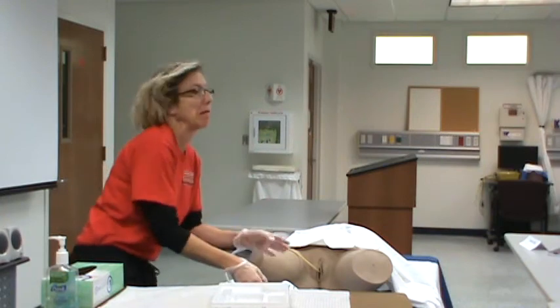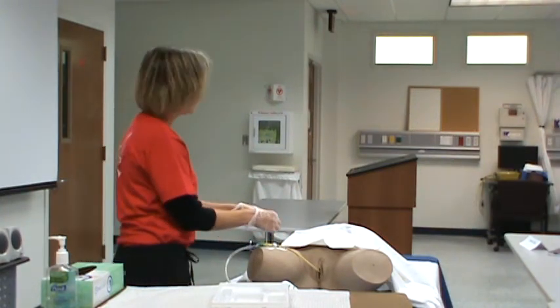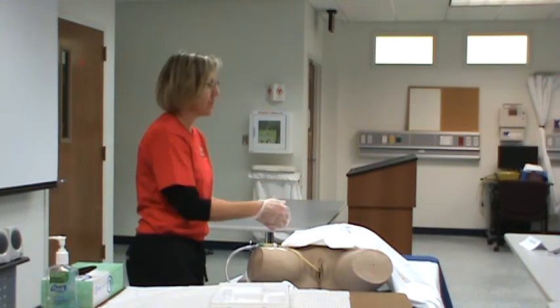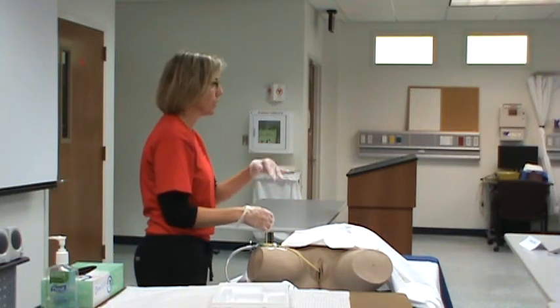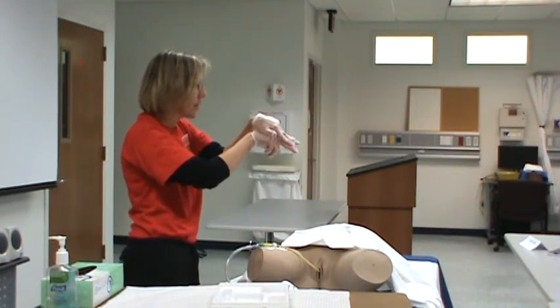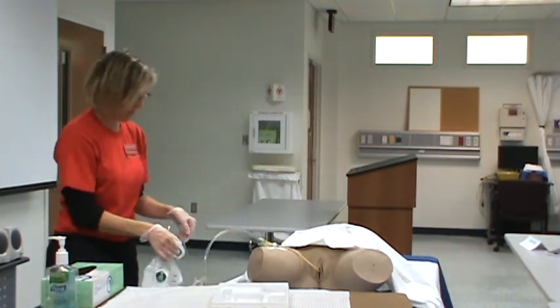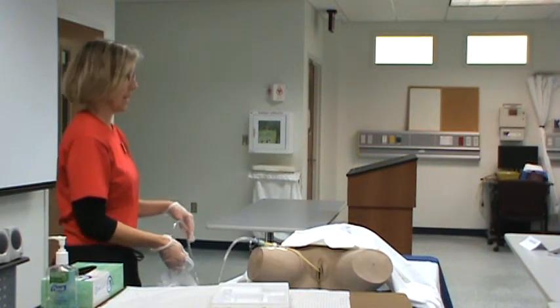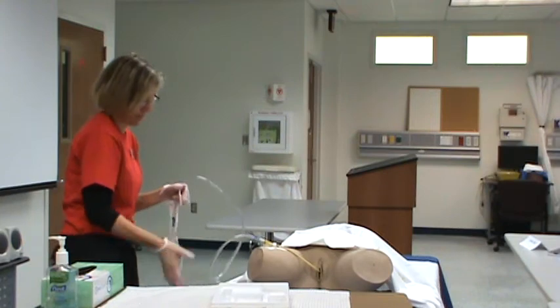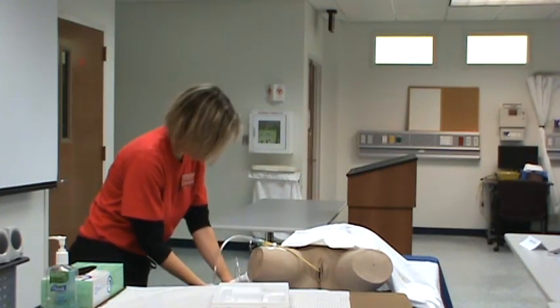Okay, the Y right there, sir? The Y you want right there at the connection. Yes. And you'll see once you guys get to practicing that it's very simple to secure, and we'll show you during practice if you really need to, but it's got a Y bifurcation, and that's where you tie the tubing. And then the rest of the tubing, like I said, goes on a non-movable part of the frame of the bed. And then you want to take your clip, your little clothespin, and secure it to the sheet on the bed.